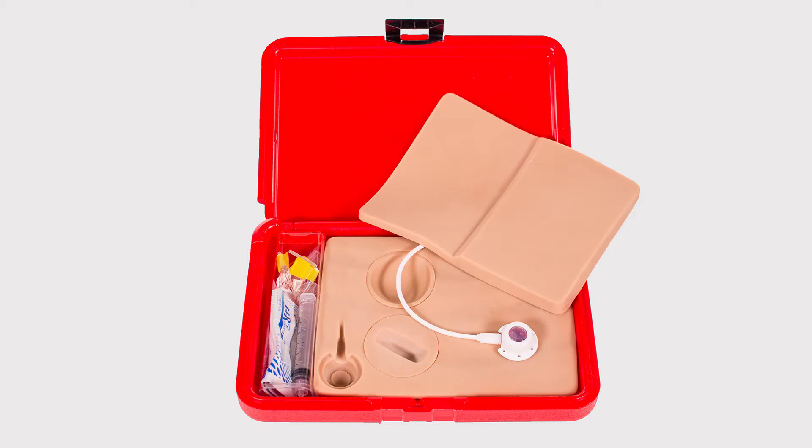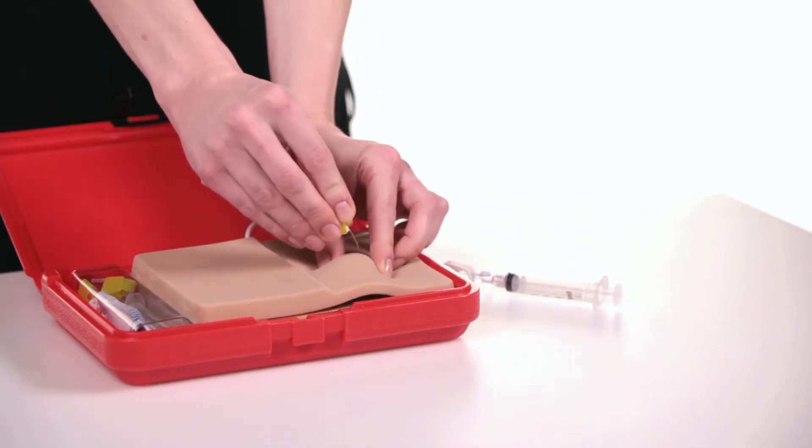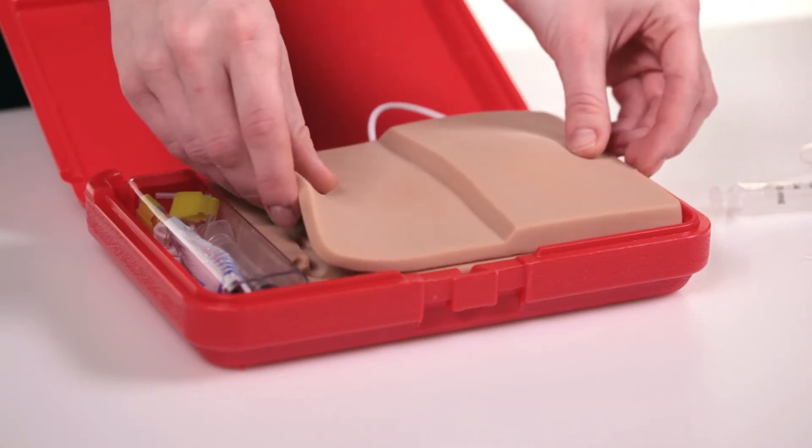When you open the model, you will notice it has a skin flap with two thicknesses. The thinner side is used to demonstrate accessing a port at a standard depth and the thicker side a more deeply placed port.